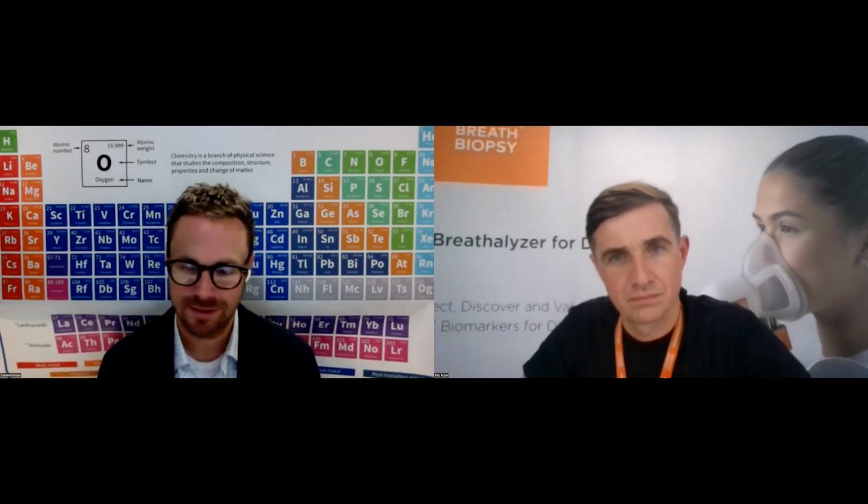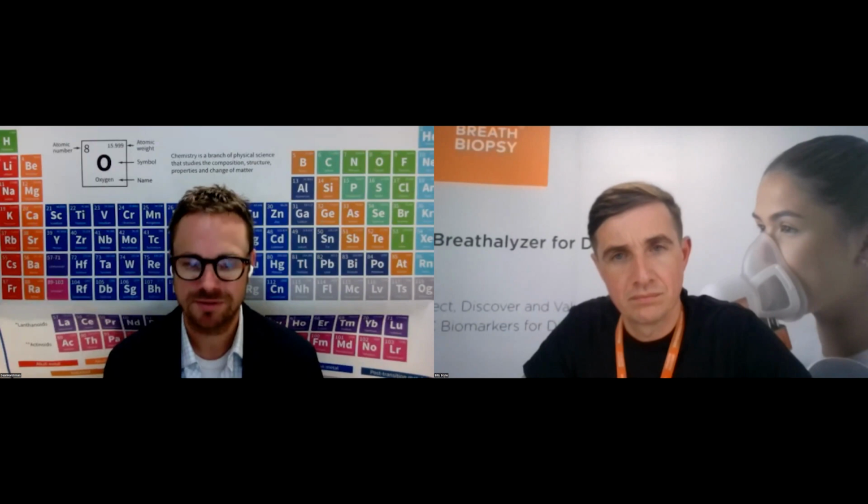Now, I will say that it was a small sampling size, that I believe more work should be done there. We are actually moving towards something similar to what Christina Davis's group has done. So you would hook your pump to a real-time flow rate sensor, and it does a real-time calculation for your collected volume. And so it turns itself off. It's basically a 3-way valve and a real-time flow rate sensor. And so that gives you a more consistent result from your bag every time, independent of the TD tube, because you're measuring that flow rate in real time. And so we have gone this approach, and we've made something that we've started using that's very similar to what her group has published.